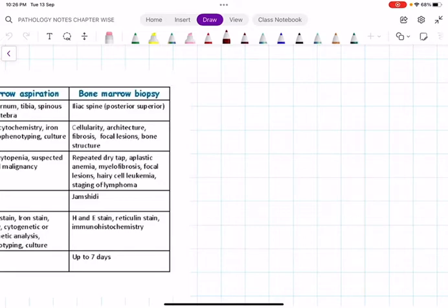I am filling a balloon with water, and using a needle I try to aspirate the fluid. That is aspiration. The same balloon I am filling with ice cream, and I try to get it. You can very clearly understand that in aspiration the fluid comes very easily, whereas that's not the case with ice cream.